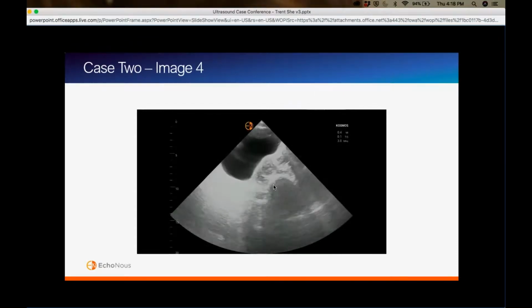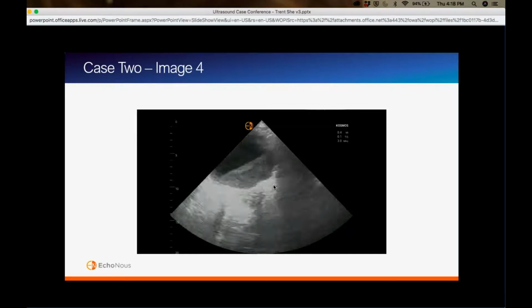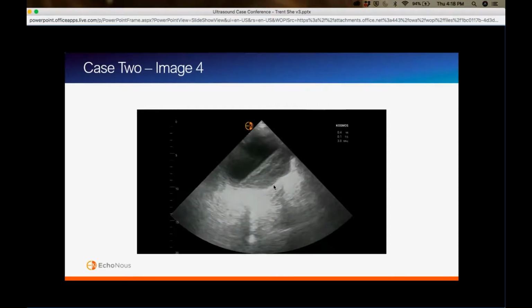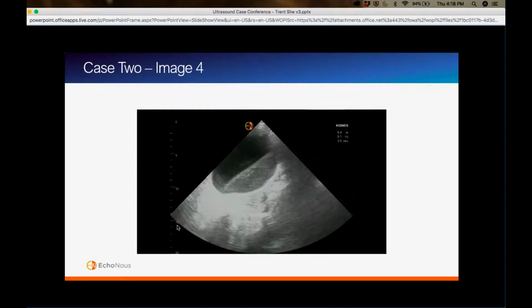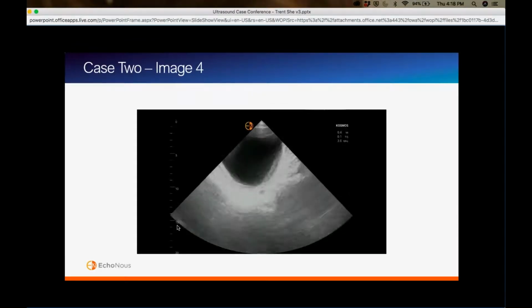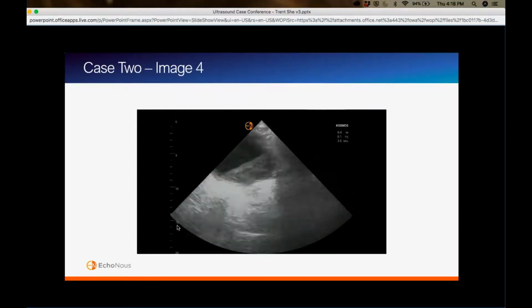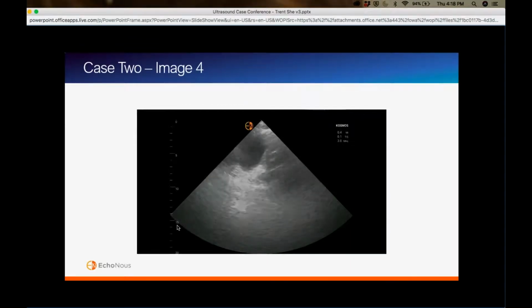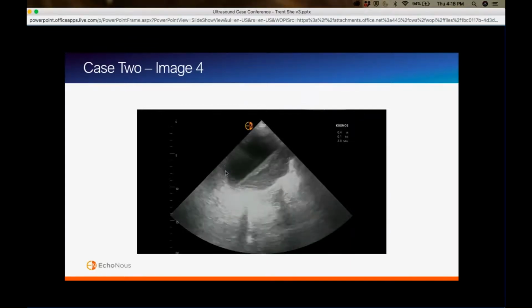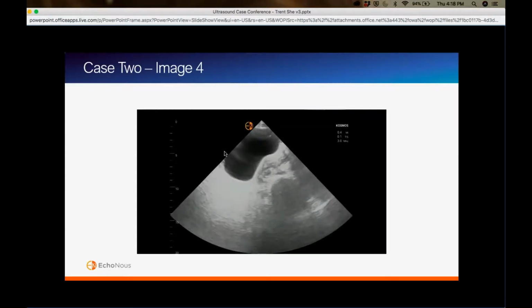And you know what? It turned out, common things being common, our elderly patient who had a fall had a really significant urinary tract infection, to the point where we could see all the bacteria growing on ultrasound, which I've never seen before. That's crazy.